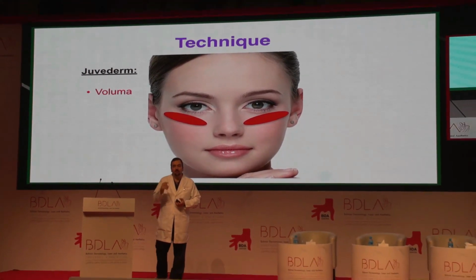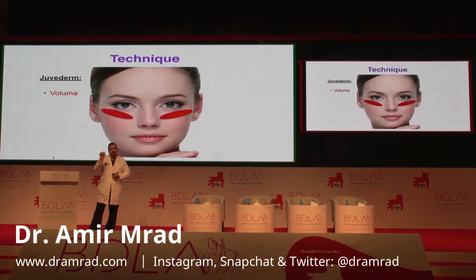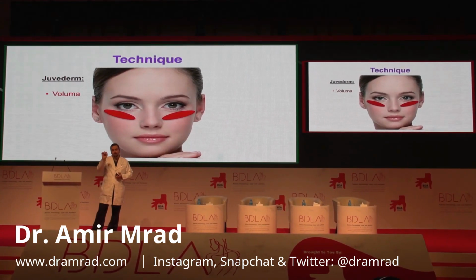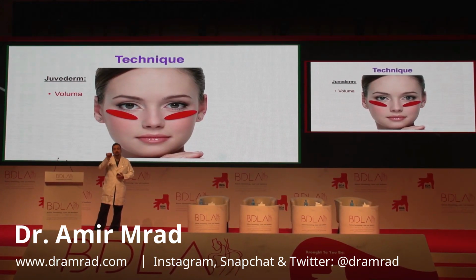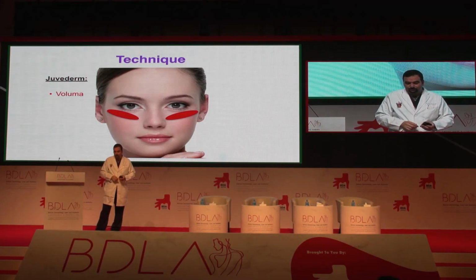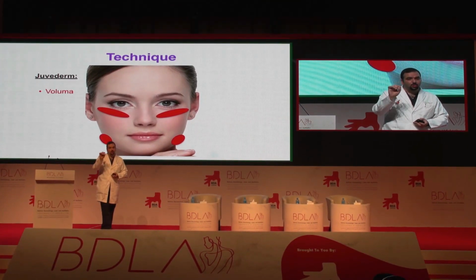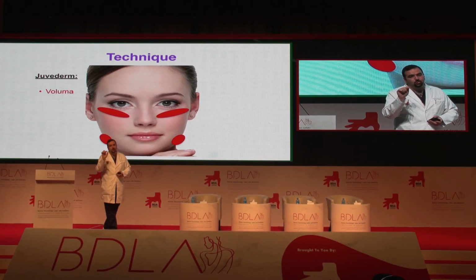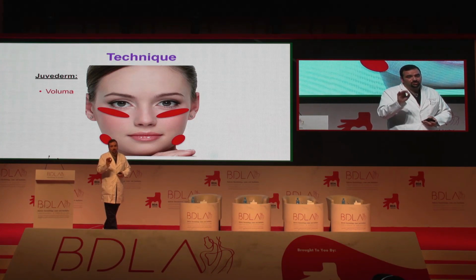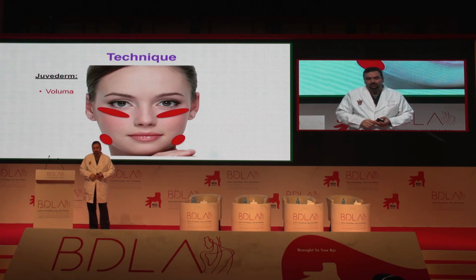Malar eminence, I start on the most prominent area, and in my technique it's just one skin puncture, and then I manipulate the needle underneath the skin to inject further, medially and laterally. I do the same on the angle of mandible, so at the angle I inject I go one puncture hole, go down to the bone using sharp needle, hit the bone and inject my product.